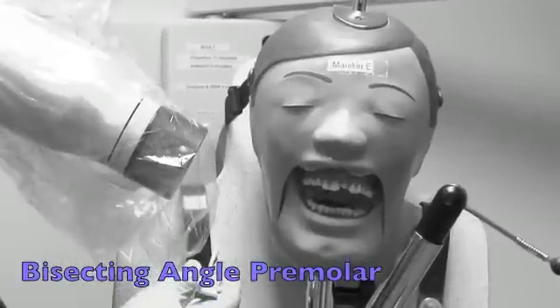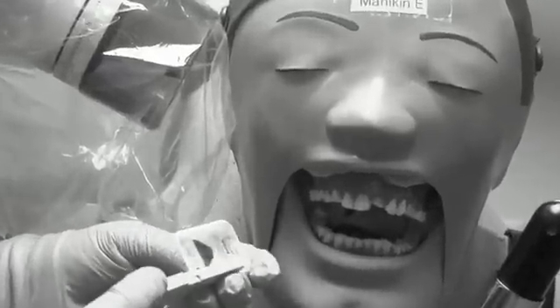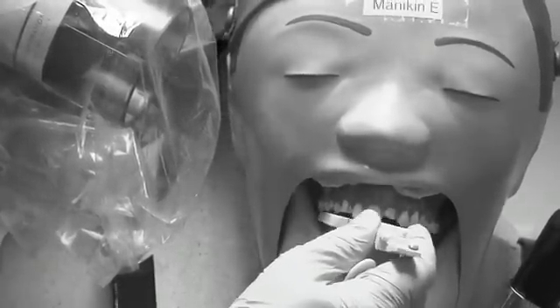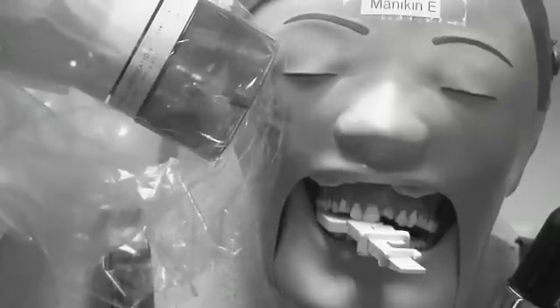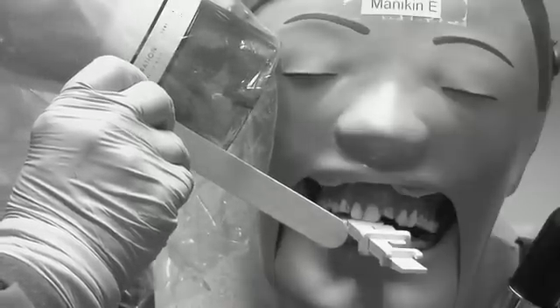For the premolar view, I've already set it for a positive, or plus, 30 angulation. The film dot goes in the slot as before. We're going to have the film pulled up as far forward as we can to get the distal of the canine on this one. Line it up with the red line on the tragus-ala line of the patient. Check the front of the PID to line up with the holder so you don't cone cut. That would be the premolar view.